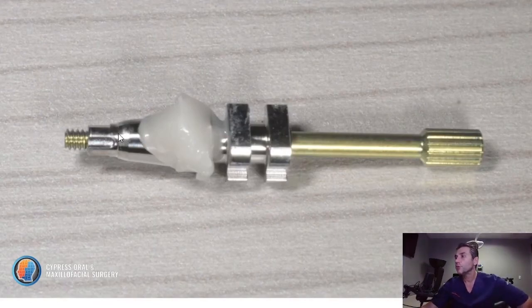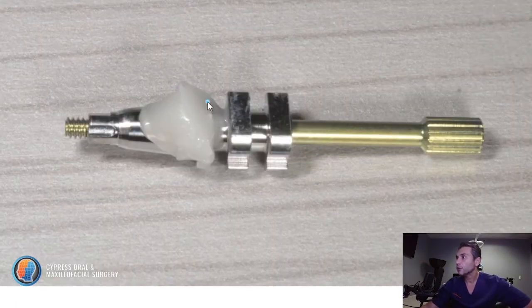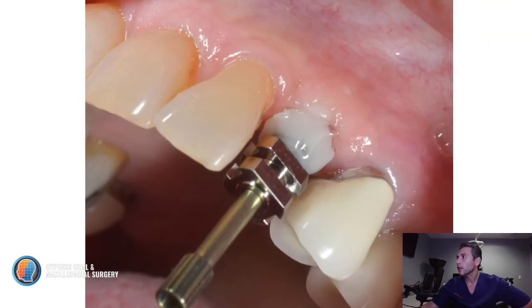So now you have indexed for the laboratory how you want the gum to look, and we transfer this whole thing to the mouth. Again, I recommend you use a little black marker to mark where the buccal is, just so you don't get lost, because some implants have like 6 degrees of rotation. You can easily get lost in there. And then you won't be accurate, and you relay wrong information to the laboratory. You put it in the mouth.